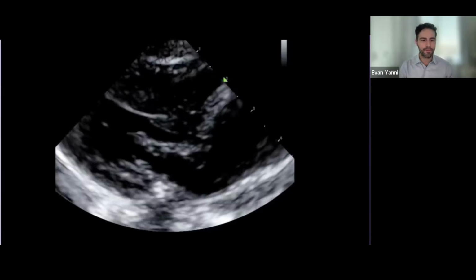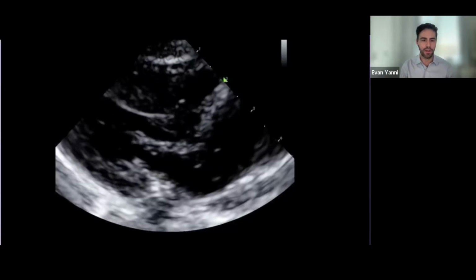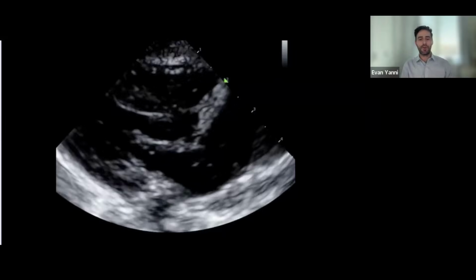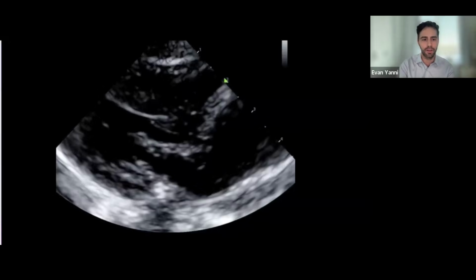So you're in the ER and you're looking at this clip and you're resuscitating a pediatric patient in cardiac arrest. On the pulse check, the patient's pulseless, and you simultaneously obtain the parasternal long axis view of the heart that you see here. And so my question is, do you think cardiac standstill? Just yes or no. And do you think your colleagues would agree with your interpretation of this? Do you think everybody would agree that this is or is not a cardiac standstill?